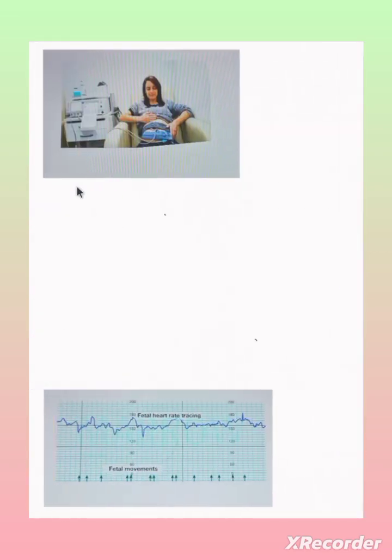Procedure of doing NST. So ask the female to lie in left lateral position. Okay, left lateral, and you are going to tie a belt around her abdomen. Okay, I'll show you a picture. You are going to tie like this. A belt is tied around her abdomen. So this belt will be connected to this CTG machine, and this belt will have sensors.